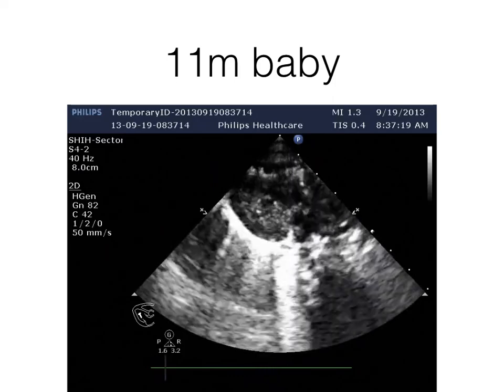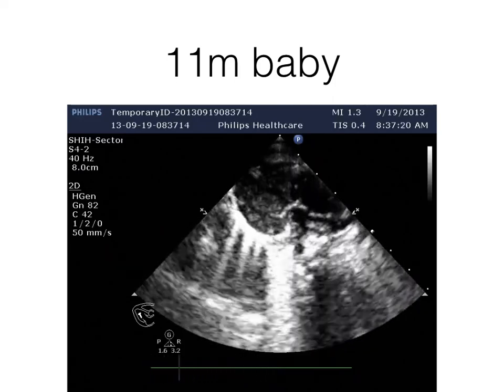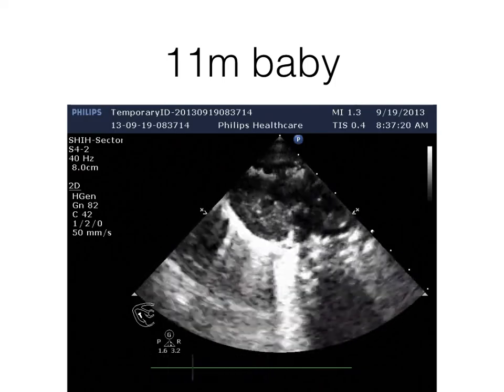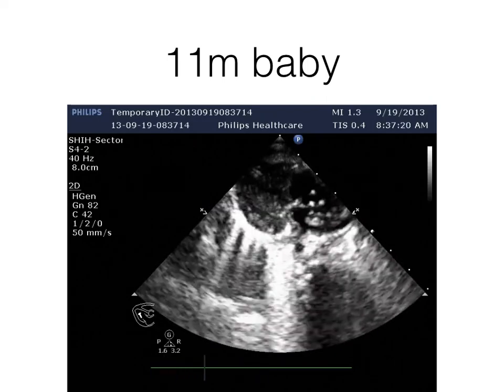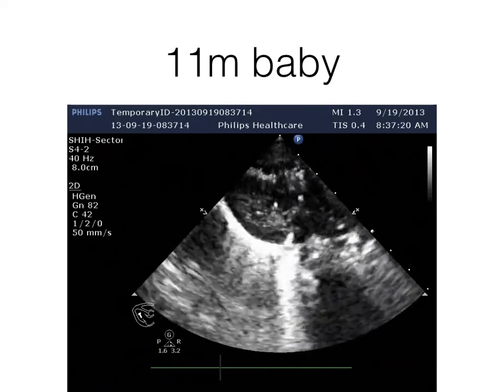Young, really young, less than 1 year old. What are we doing? Chest compression. We are doing chest compression and scanning from the subxiphoid without interrupting the chest compression.